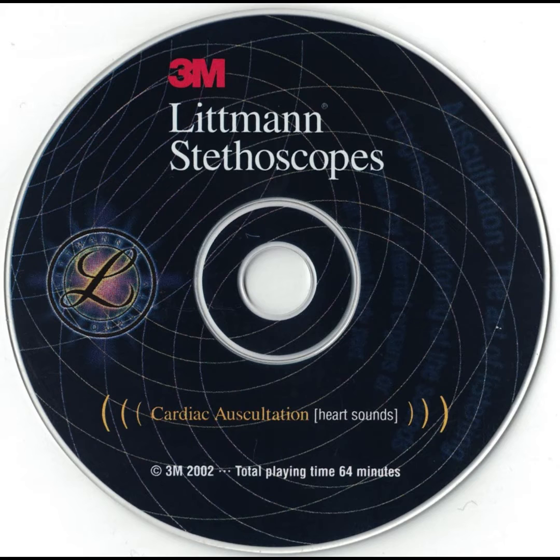Tricuspid T1 closure is the second component of the first sound. It has less intensity behind its production and may only be audible at the left lateral sternal border. A split of the first sound occurs when both components that make up the sound are separately distinguishable. In a normally split first sound, the mitral and tricuspid components are 20 to 30 milliseconds apart. A split of the first sound is heard in about 70% of normal subjects and is heard best at the LLSB, with the diaphragm firmly pressed. Listen to a normally split first sound.